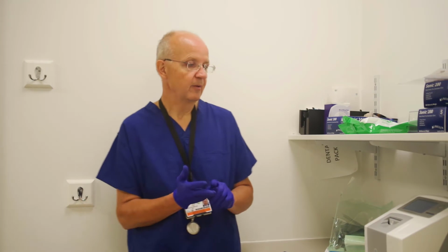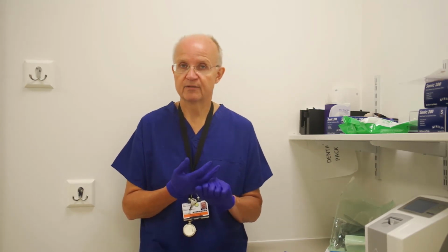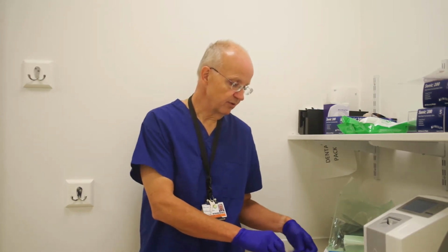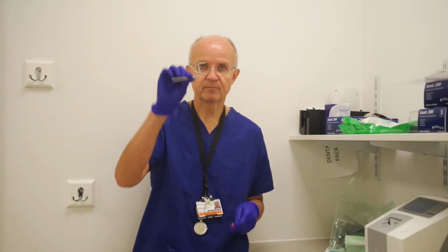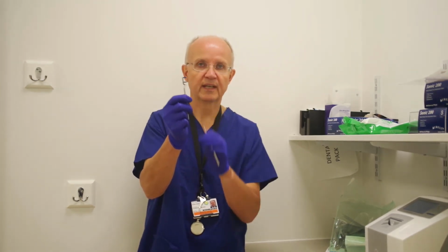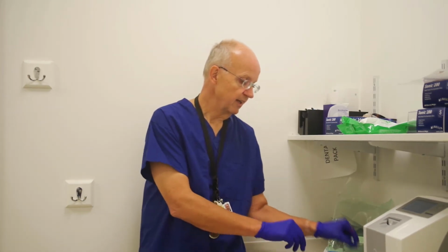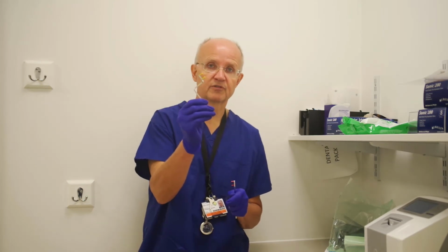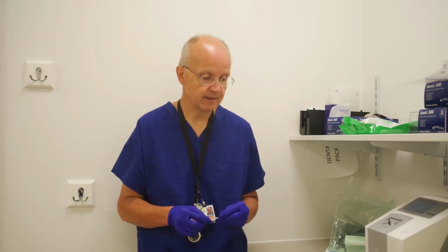Okay, so the other holder I'm going to show you is the bite wing holder. You remember that the posterior holder was yellow, the anterior periapical holder was blue, and the bite wing holder is red. Just one thing to point out, which I forgot to mention before: the bars that we use as part of the beam aim device have little colour codes at the end of them. That one is blue at the end, so that's an anterior one. This one is red, so that's the bite wing one, and the posterior one has yellow prongs on it. So if you get them confused, you should be able to identify them fairly easily.